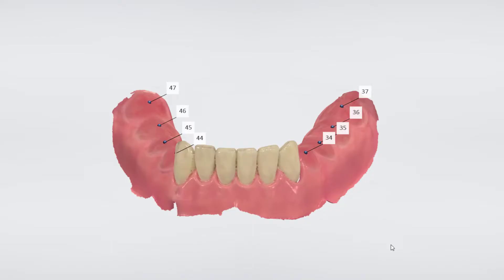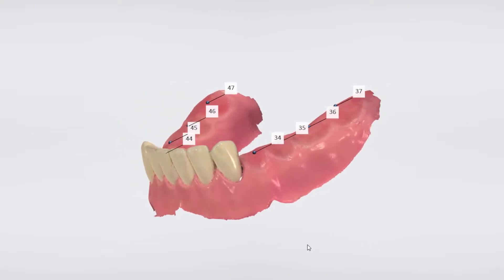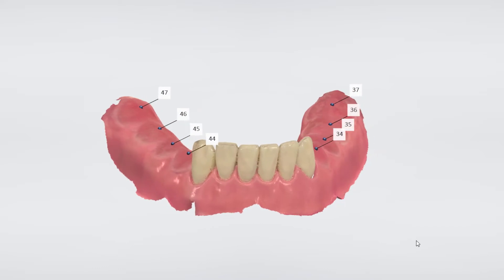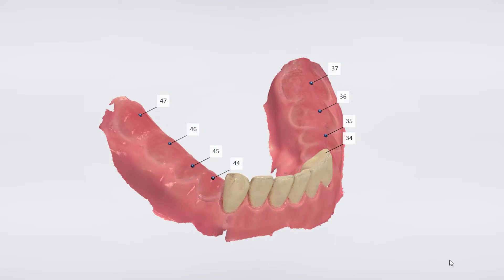Here we've got a dual-sided free-end case, with no teeth posterior to the canines. This type of partially edentulous patient is very common. They often have a long history with several RPDs. Due to the degeneration of the supporting bone and the constant movements of the denture, they often come to us seeking help and requesting implants.